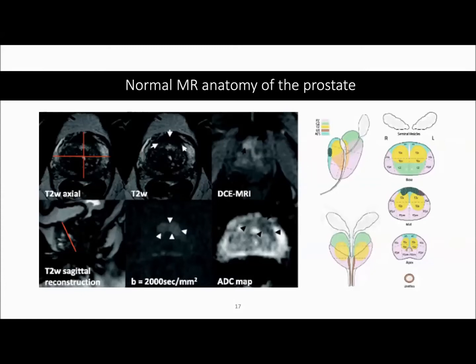And even missing small details can actually result in distortion and may affect the quality of image. As a consequence, it's important that the MRIs are done following all that is described by Dr. Shayan. Basit, you want to add something in the acquisition before we move on to the normal MR anatomy?